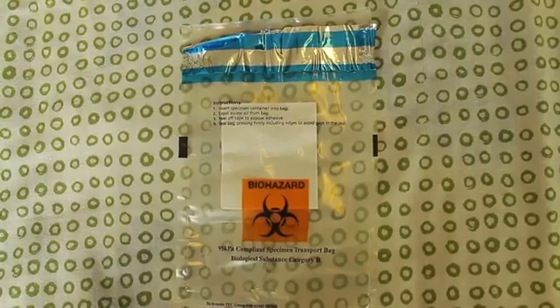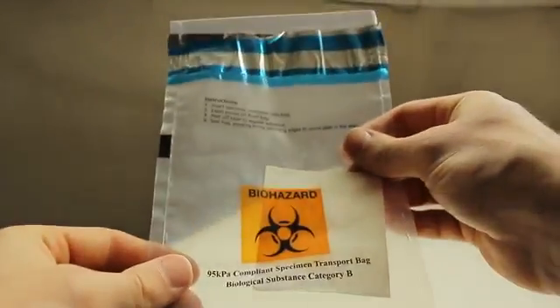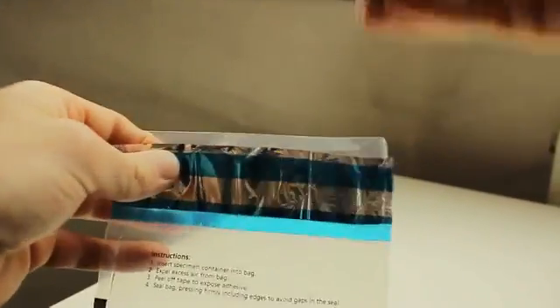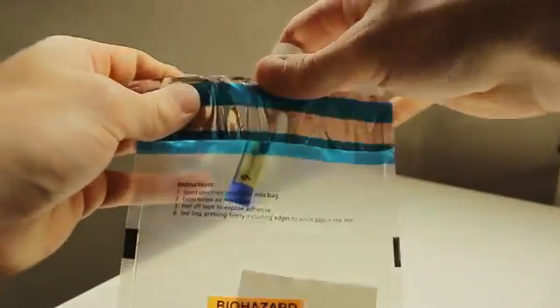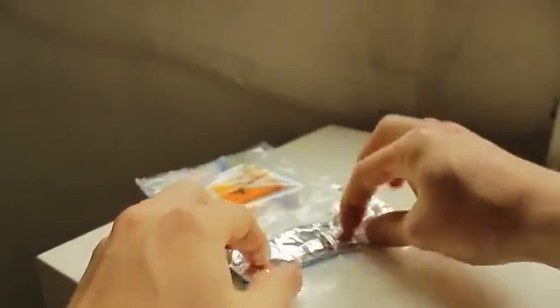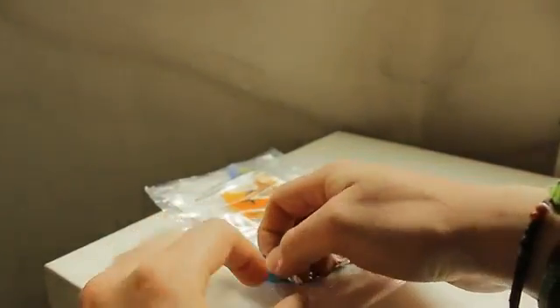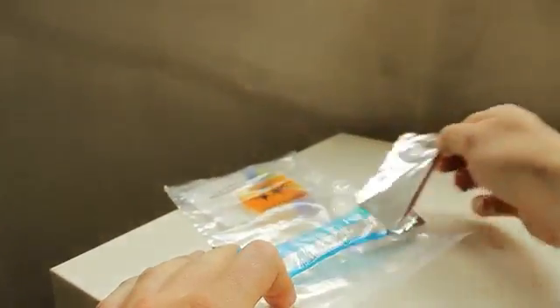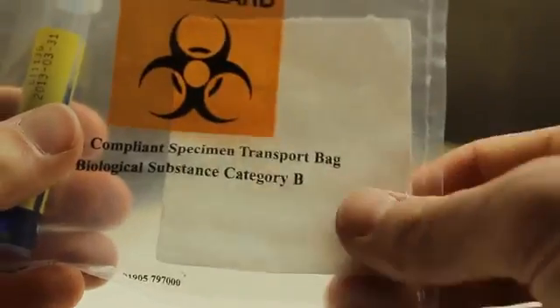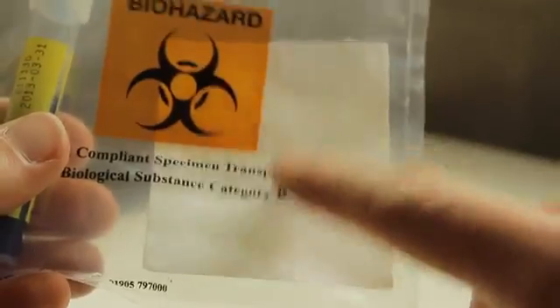Now for the specimen bag. Don't be put off by the biohazard sign — your sample is not a weapon of mass destruction. Put the test tube in and make sure that all air is out of the bag. Then take the full strip off to reveal the adhesive, and seal it up. This square bit of material is here so that if the test tube breaks, it soaks up all the solution, so that the postman doesn't get any nasty surprises.